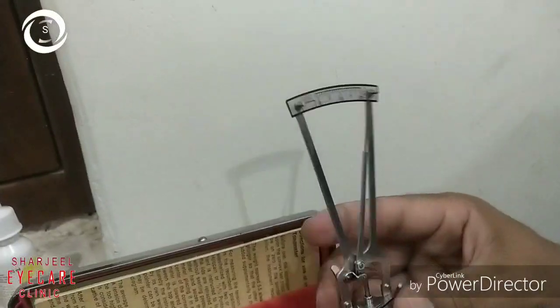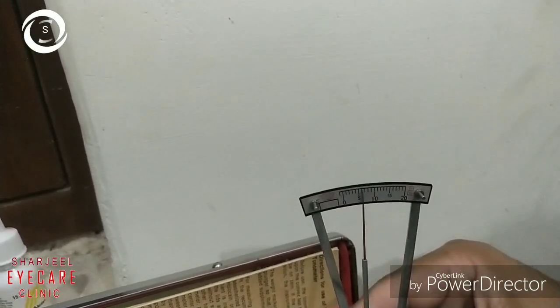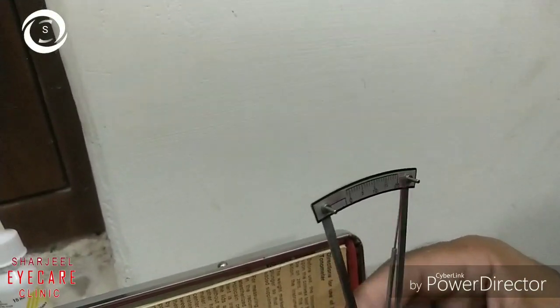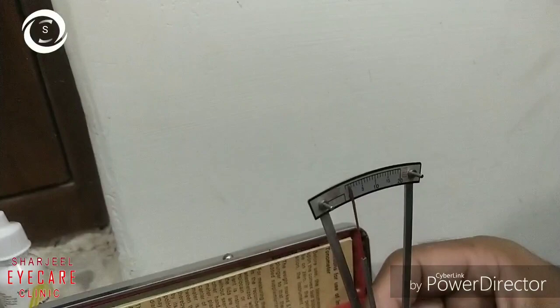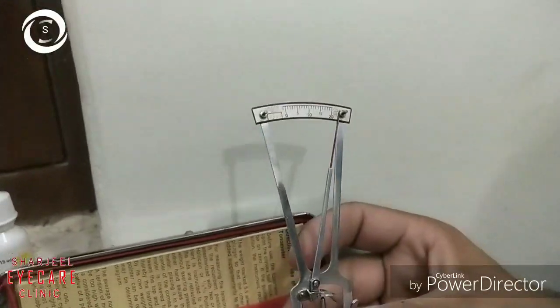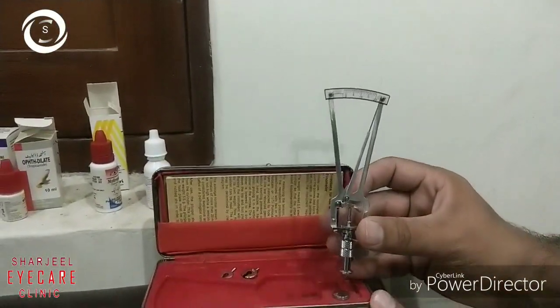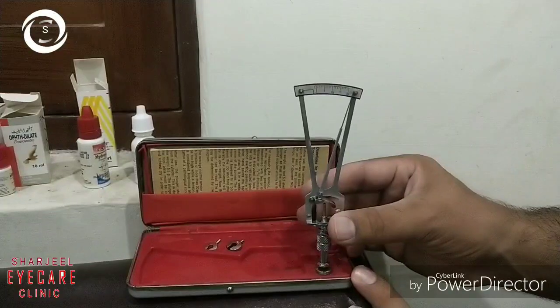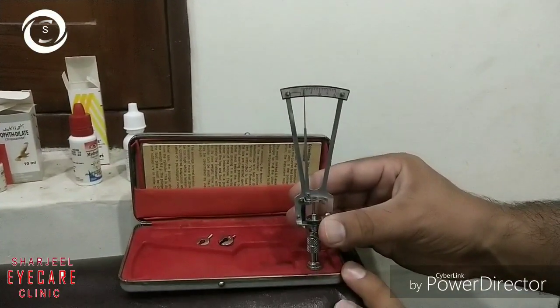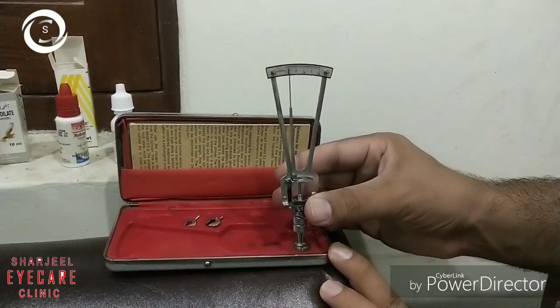Test the tonometer on the test block to confirm it is functioning accurately. Press the foot plate on the test block and hold the tonometer upright. If the needle points to zero on the scale, as you can see on the screen, it means it is accurate. The needle is freely movable, confirming the tonometer is working correctly.